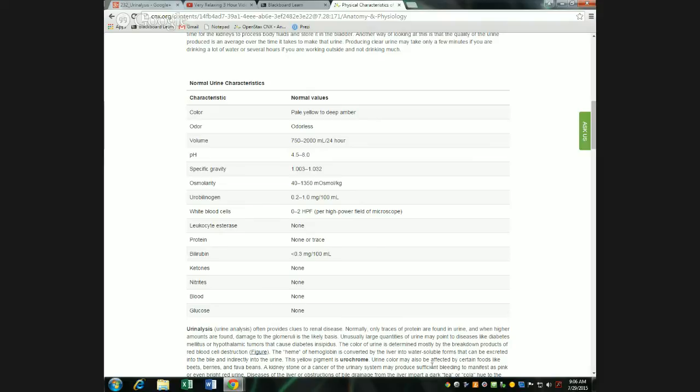Actually, it's kind of weird. It gets really thick too. So it'll really freak the hell out of you. Yeah. If it was clear when you got it and it's cloudy now, don't worry. That's just a matter of the temperature change. And that's not happening in your body because your body is not room temperature. So don't freak out about that. But those are the sorts of things that can make a sample cloudy like that.